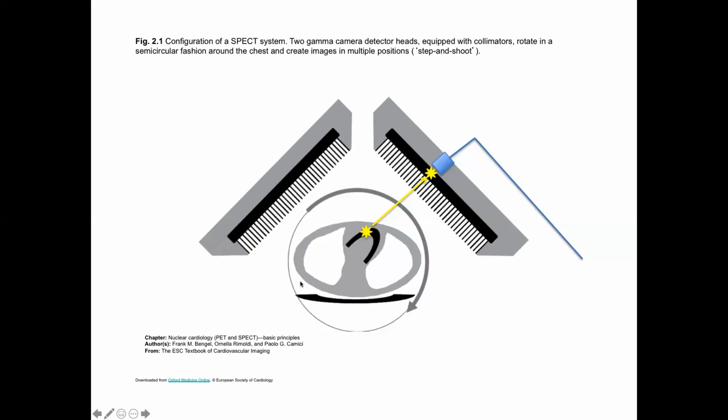And then over time, as we saw in the first lecture, you will build up a total signal along this line, which is just integrating the brightness at every point along that line mathematically. So I've got a whole set of brightnesses here, and then they're going to show up as the sum here after we've collected at this angle.